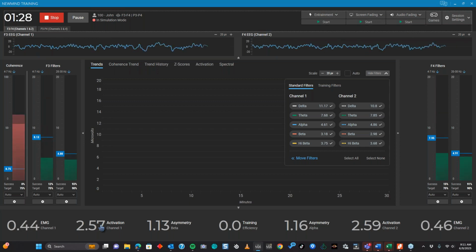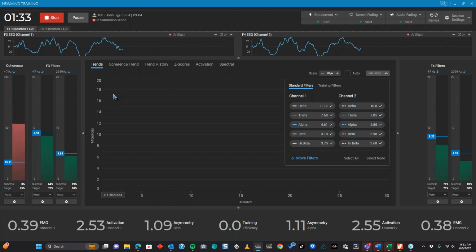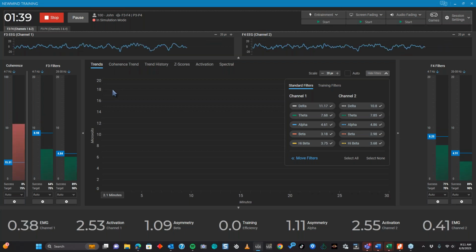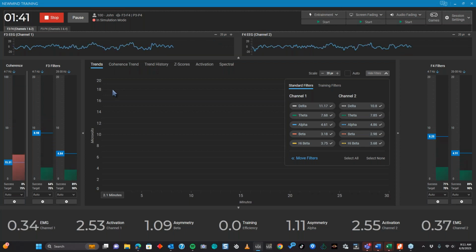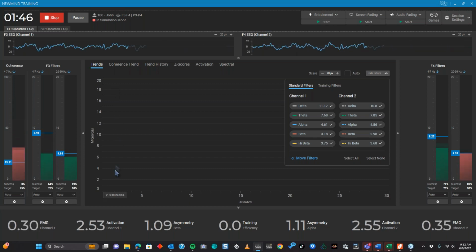If your numbers are above 3, that's actually indicating that the brain is in a state of under-arousal. If we were looking at trend lines, a number above 3 might have delta and theta sitting up quite high.